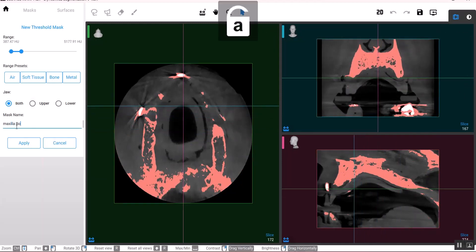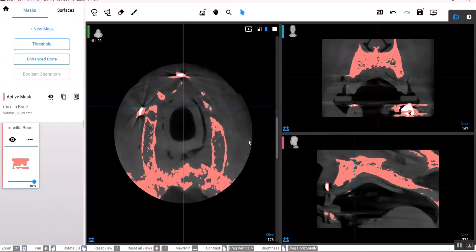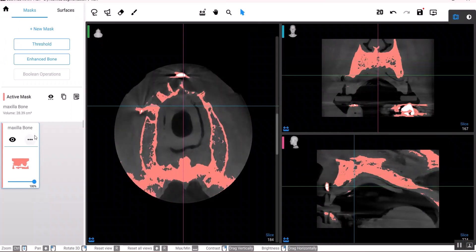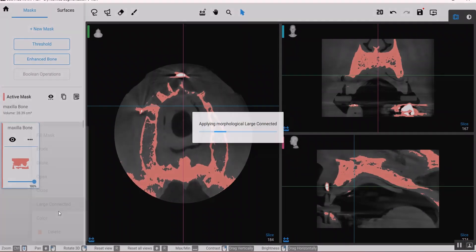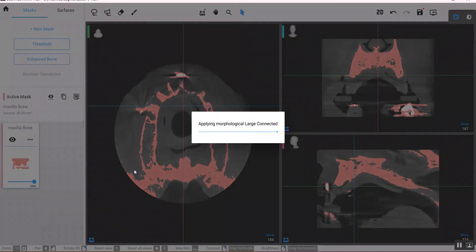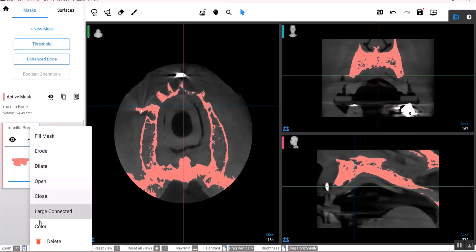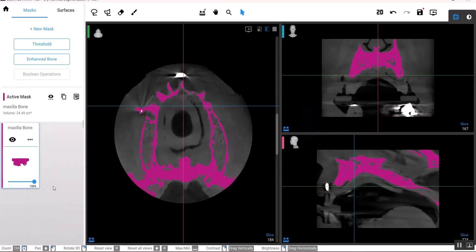Then select Large Connected, and this will remove the scattering around the largest connected area, which in our case is the maxilla. I also want to change the color and the opacity, and then I'll start manual marking for the areas that weren't marked using the brush tool.